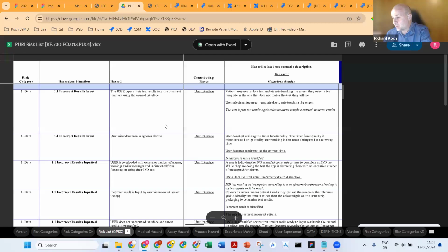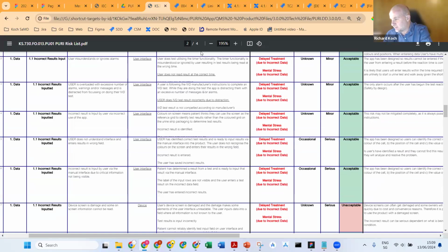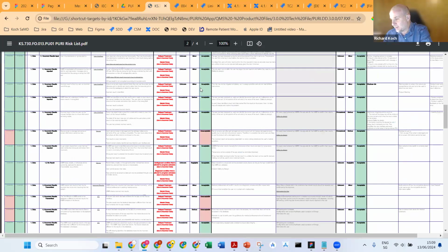this is what I worked with, which, coming from a traditional document-based quality management system, these sort of tables are very, very common. Everybody's seen them. And this is what it looks like in PDF, and that's zoomed in. I'm at 200% right, but you try and get these onto one page. I'm sure you've seen it too, where they get PDF printed, nobody can read them. And it's worse if they try to put them on paper or we have bad resolution. So, this is one of the constraints with documents.